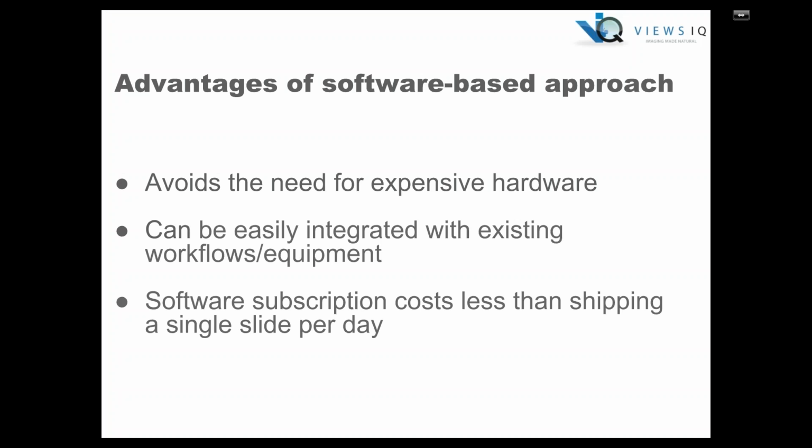And this subscription option, as opposed to the purchase of the permanent software license option, is something that we've introduced really recently, and we're very excited about because we think for the first time this makes digital pathology really feasible to incorporate for those lower throughput or those maybe more niche or educational applications.